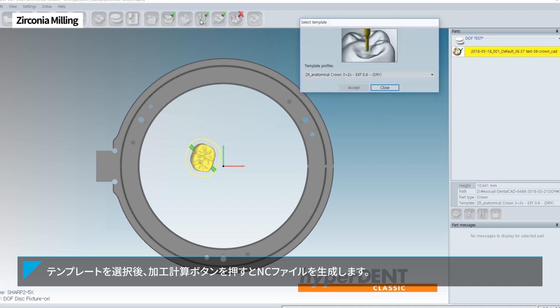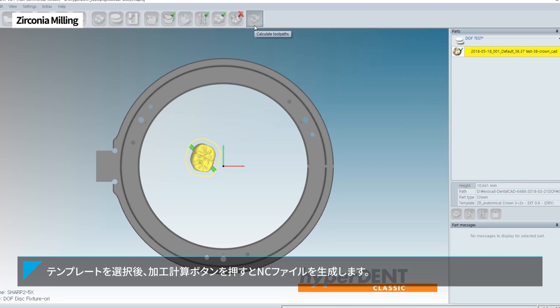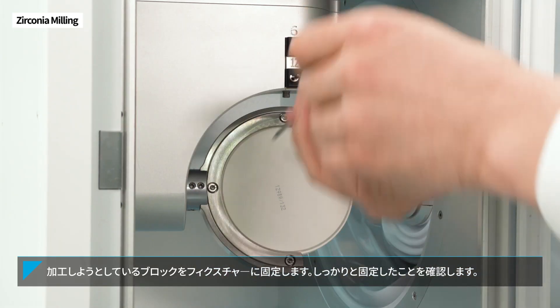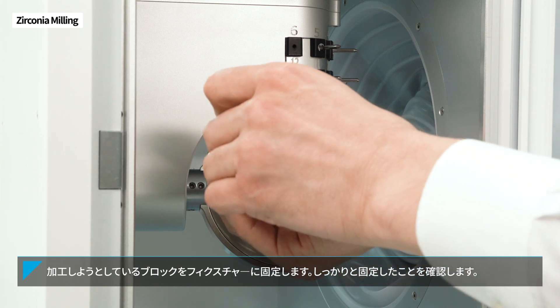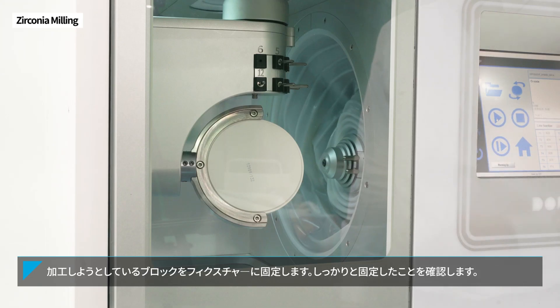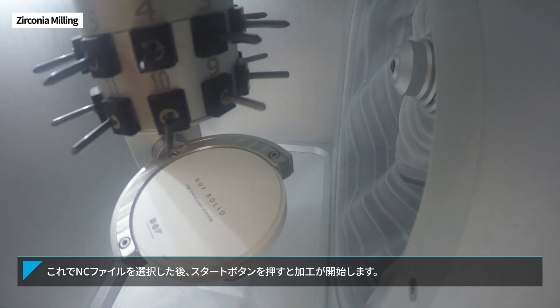After selecting the appropriate template, click the Calculate Toolpath button to generate the NC file. You need to attach the block you want to mill to the fixture. Check that it is firmly placed with no shaking. Finally, select the NC file and press the Start button to begin milling.